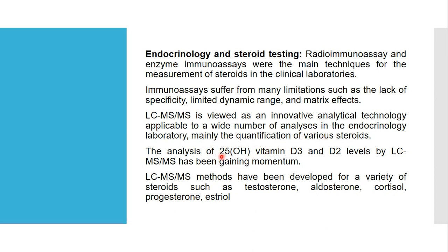So analysis of 25-hydroxyvitamin D3 and D2 levels by LC-MS has gained wide momentum. LC-MS methods have been developed for a variety of steroids like testosterone, aldosterone, cortisol, progesterone, estriol, etc. So you can see these are the various steroid hormones found in the male and female bodies.